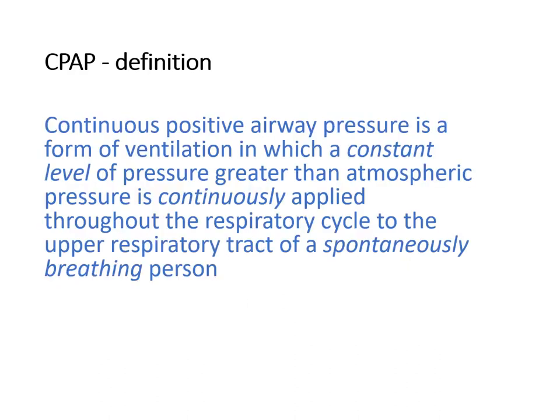CPAP is a form of ventilation in which a constant level of pressure, greater than the atmospheric pressure, is continuously applied throughout the respiratory cycle to the upper respiratory tract of a spontaneously breathing person. The most important part of this is that it's a constant level of pressure. It doesn't vary whether it's inspiration or expiration. It's given through both inspiration and expiration, and the patient should be spontaneously breathing. So this is called CPAP.